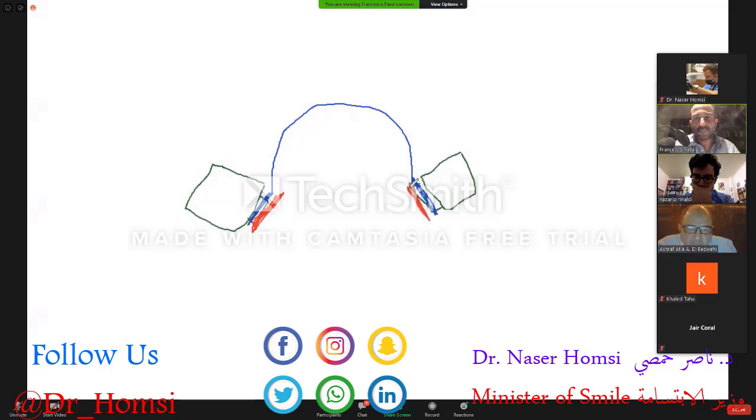Then we can insert and activate the transpalatal bar for derotation by activating the two terminals and checking on the paper that the angles are exactly the same. So the angle of left and angle of right are exactly the same.